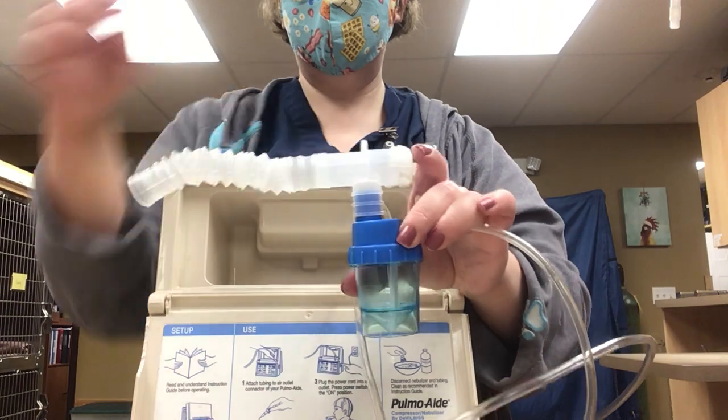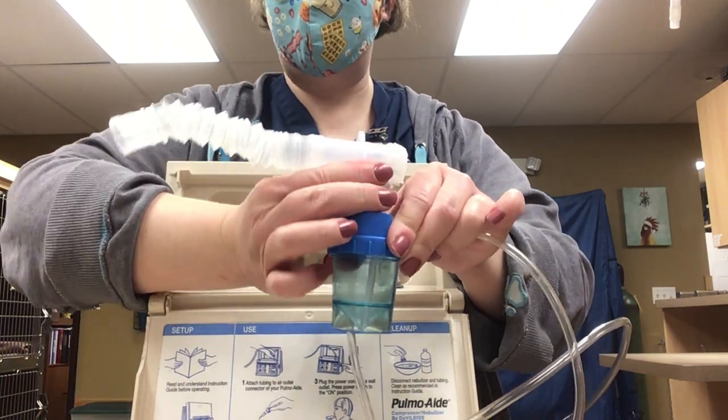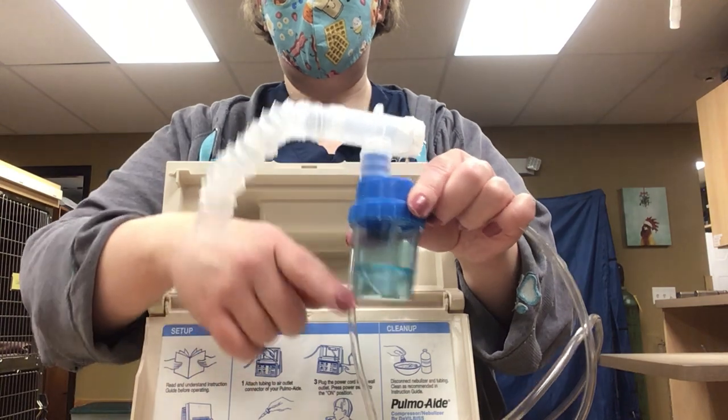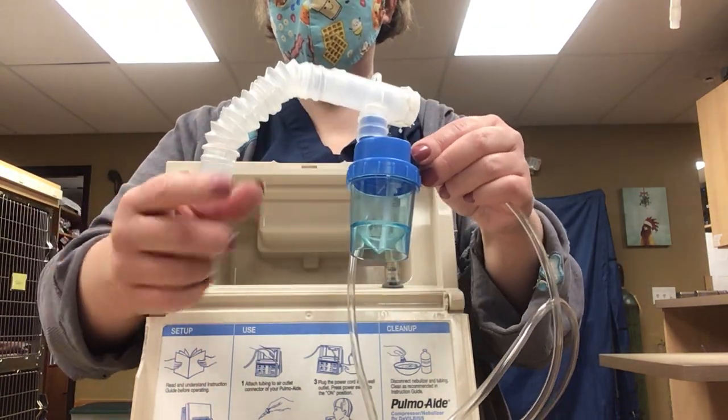This is going to hook on to your cup — again, usually it's right on top, but there should be a little diagram attached with it. Just put this in your cage, cover everything with a towel, turn the machine on, and it's going to pump air in here and basically aerosolize your medication.